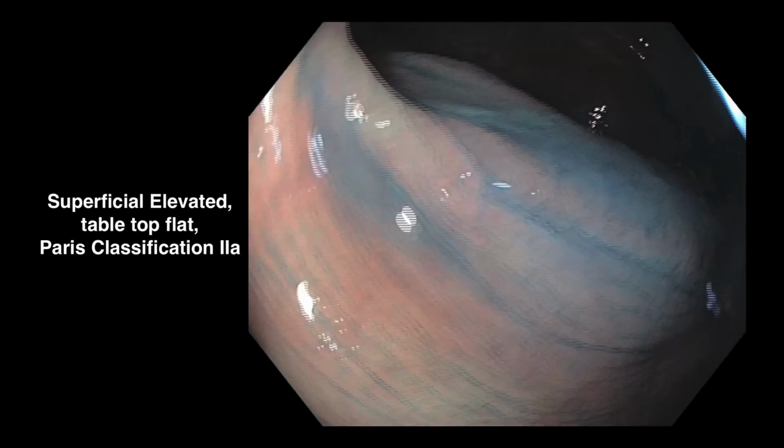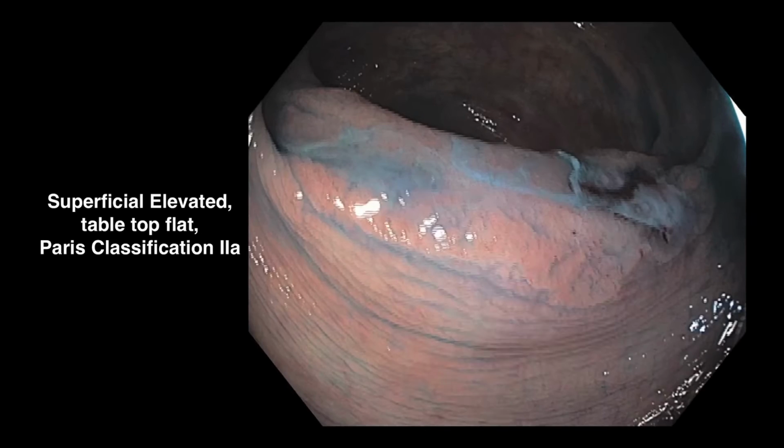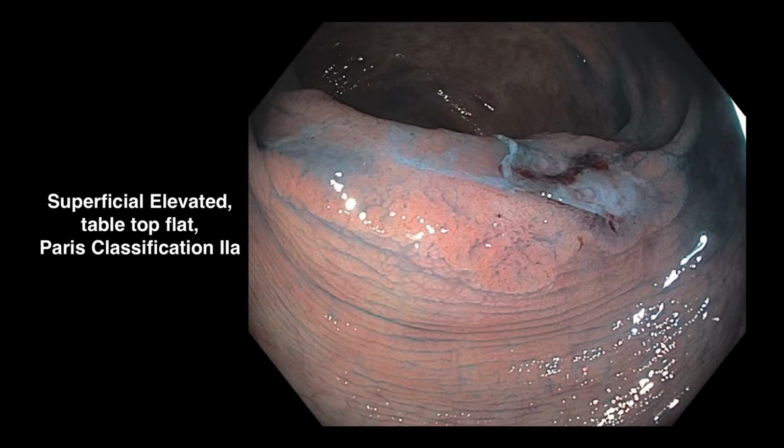This patient was undergoing routine surveillance for chronic ulcerative colitis, which had been in remission. After spraying with dilute indigo carmine, a thickened fold with ulceration is noted. The surrounding mucosa appears relatively normal. Upon hand spraying with concentrated indigo carmine, a 3 cm flat neoplasm is well seen with a homogeneous adenoma pattern. This was a superficial elevated, tabletop flat, Paris classification type 2A neoplasm.